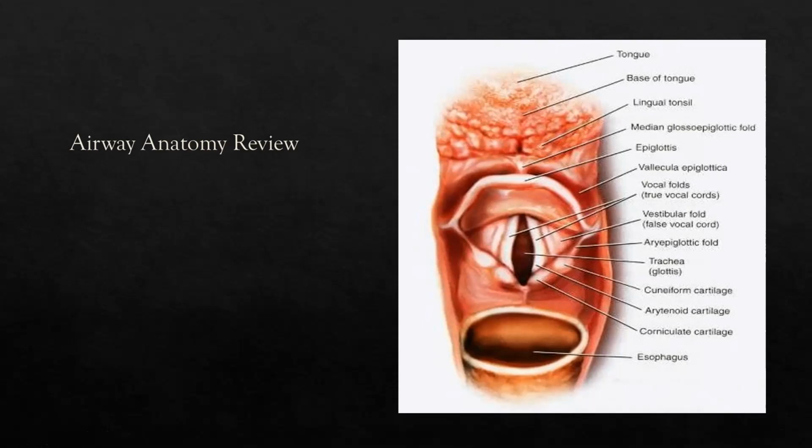When you guys come out to the lab and do that hands-on thing, we're going to talk a little bit more about one of the most common issues we have with intubation, which is intubating and going into the esophagus. If this happens, a lot of you guys may have been taught to pull the tube out and retry. Well, folks, there's only two holes in there. So if you have placed a tube in the esophagus, you know you've got one in there. Why not leave that tube in place and grab your other tube, go back and look, and you should have an easier time actually placing the endotracheal tube into the right space.